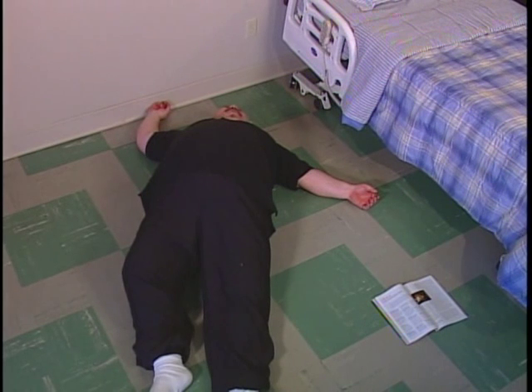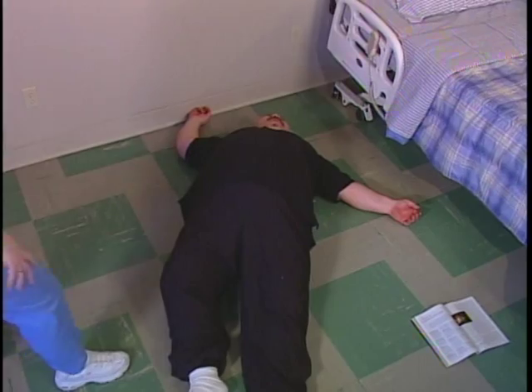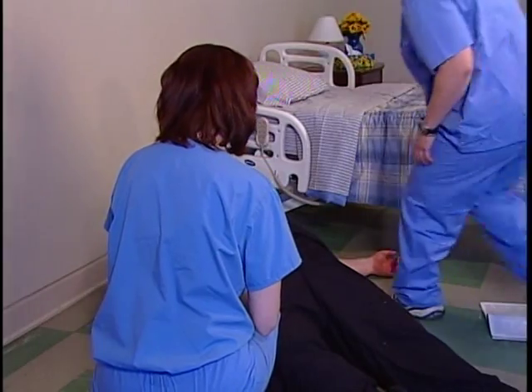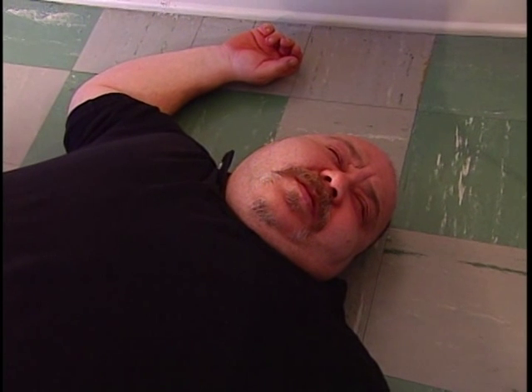The lift can be a useful tool in picking up a resident who has fallen to the floor. Bill, what happened? Are you okay? Yeah, I'm all right. The first thing to do in these situations is to determine if the resident has suffered any injuries from the fall. How about your legs? Are your legs okay?